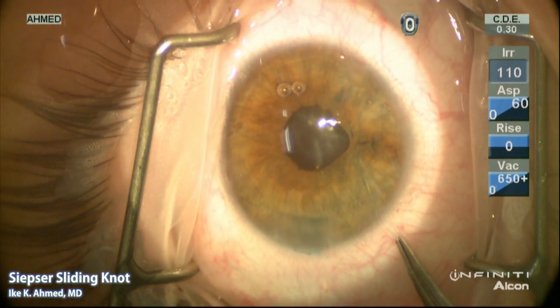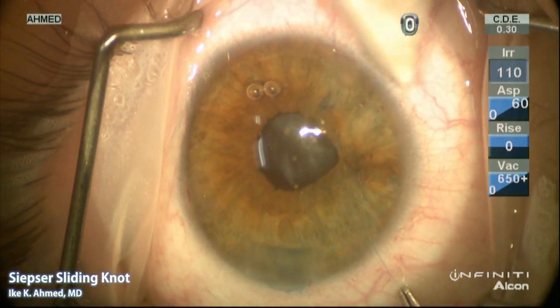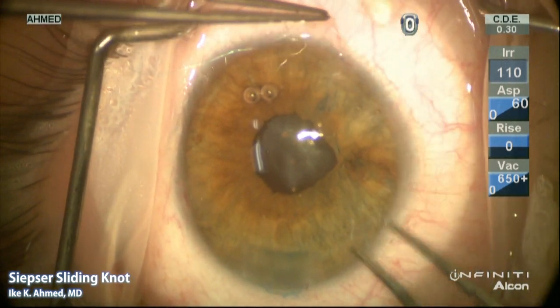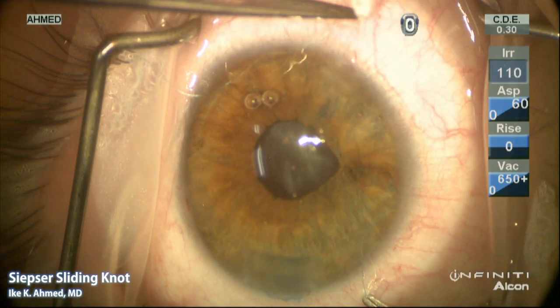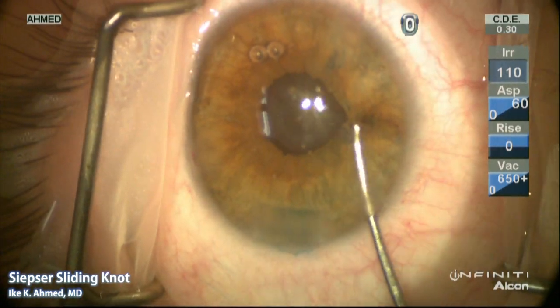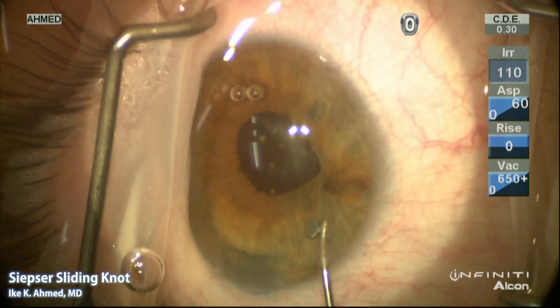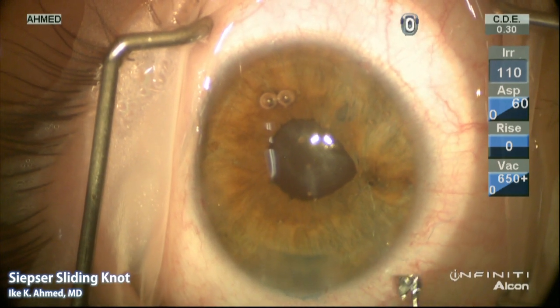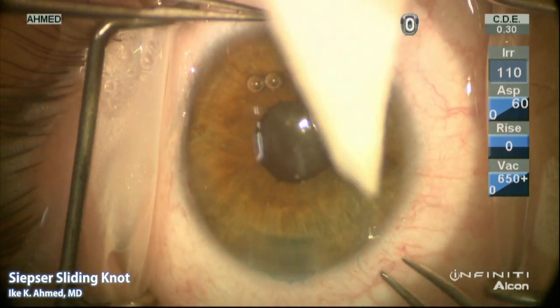The lock is important to ensure we have a secure knot. It's very important to distinguish between the distal and proximal strand and the distal and proximal paracentesis through which each suture strand emerges. We will then for the last time use a Kugeln hook to loop the distal strand to create the distal loop.